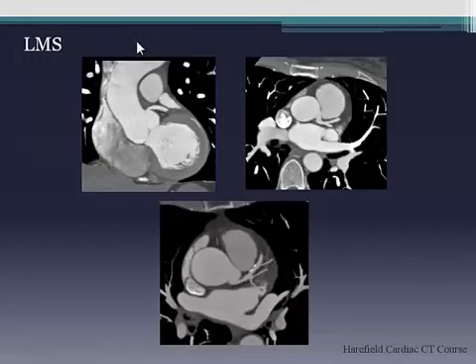And it's really important that you develop a system, especially when you're first starting cardiac CT, because it can be quite overwhelming. Those of you from a radiology background know about this concept of satisfaction of search. You'll see a stenosis, you'll feel really proud of yourself because you've seen a stenosis, and then you'll miss all the other problems in the heart. And that's the quickest way to destroy your service, okay?